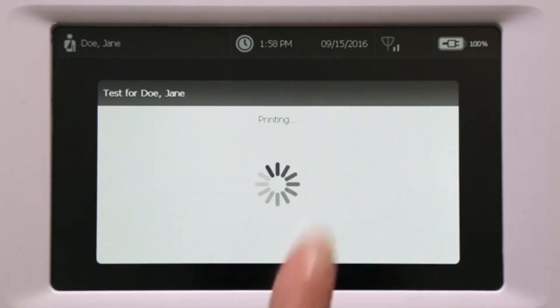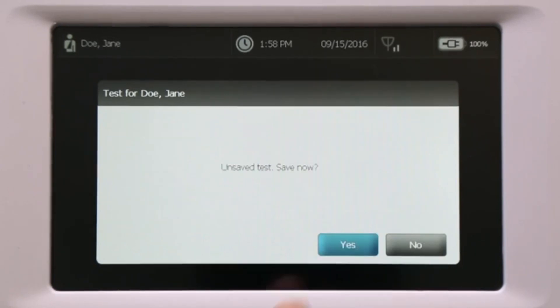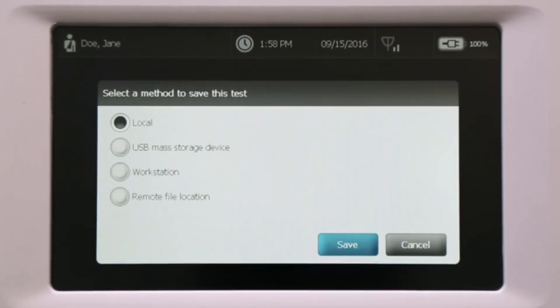Touch Done when you have completed the post-tests. After completing the spirometry test, you can save and/or print results. The test can be saved to several options: internal device memory, as a PDF on a USB mass storage device, or as a PDF in a network folder.